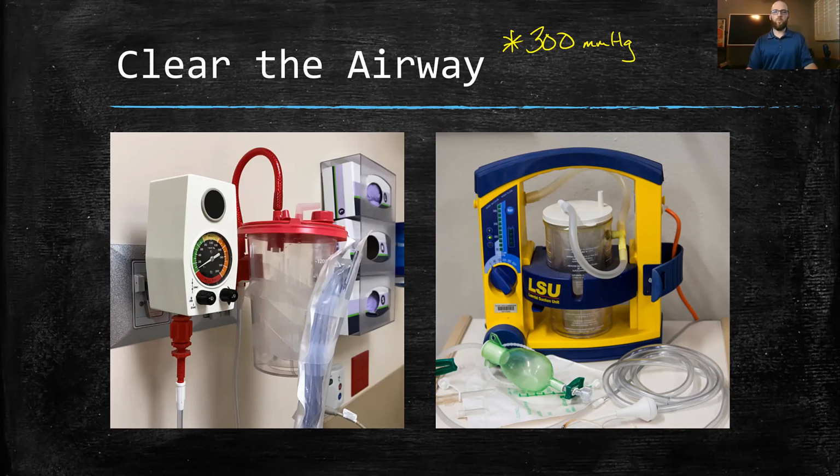All right, so with the suctioning, once we've done the log roll, having gravity help us out clearing their airway, then we make that decision of, okay, let's suction. There's really two typical styles.